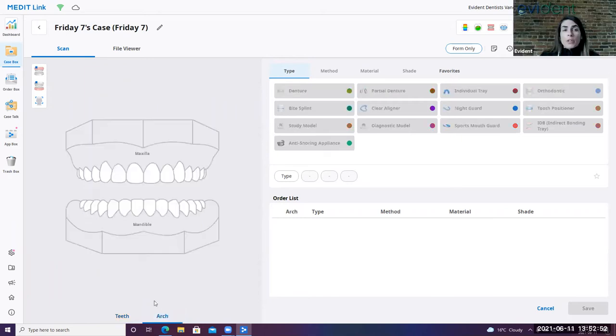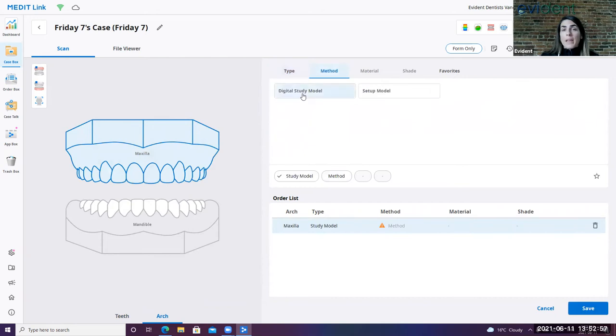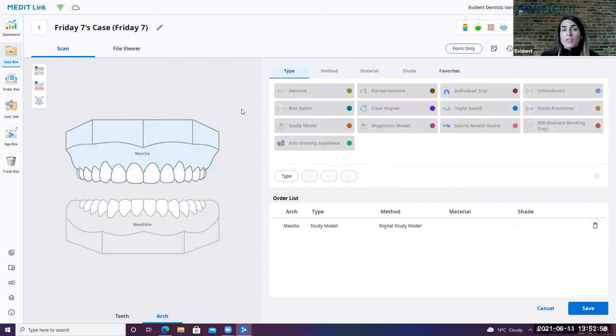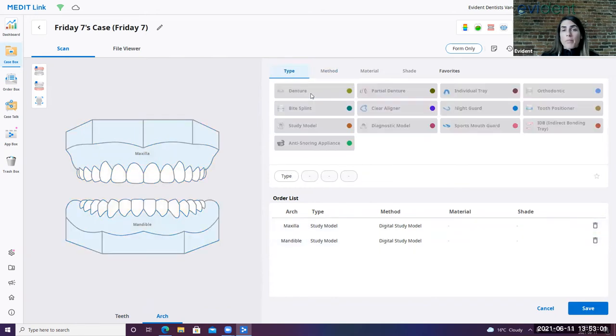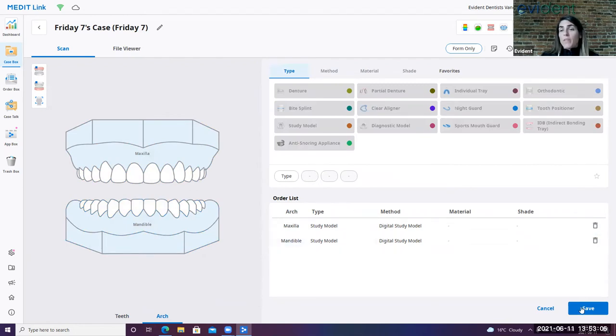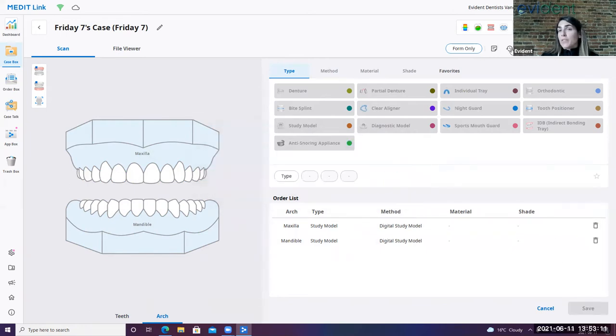For the purpose of our demo, we're going to go ahead and do a set of study models. So you'll click on the upper study model, digital study model, and you'll do the same workflow for the lower. Once you have your prescription set here, then you're pretty much ready to go. You do have the option of saving your prescription here, or you can just go ahead and click to scan if there's nothing else that needs to be noted.